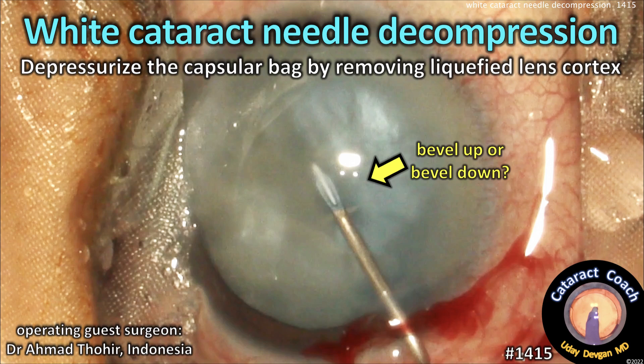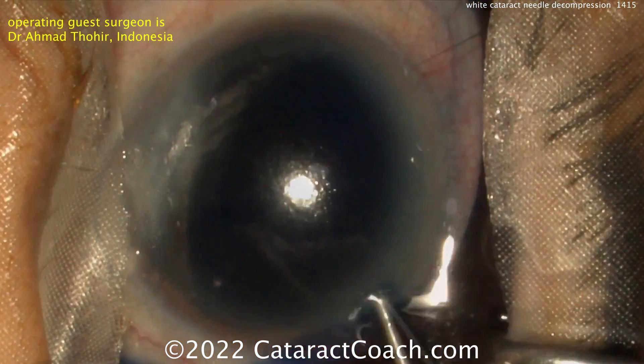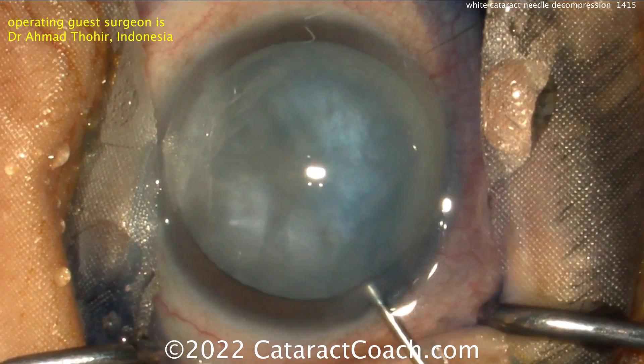CataractCoach.com — White Cataract Needle Decompression. You can depressurize the capsular bag by removing liquefied lens cortex. This is meant for an intumescent white cataract. Our guest surgeon here is Dr. Ahmad Thawir from Indonesia.